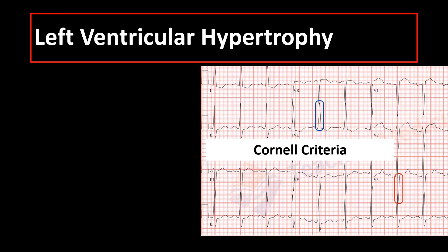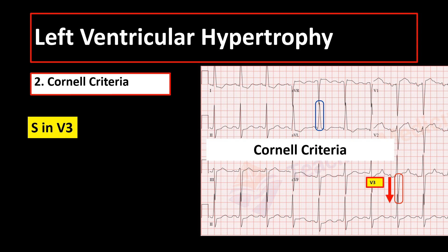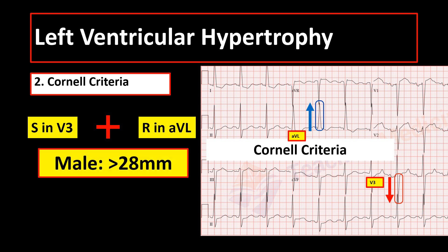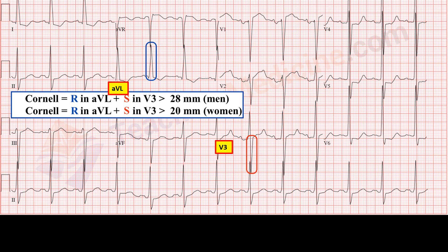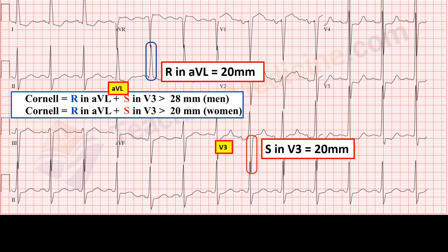The next criteria is the Cornell criteria, which is the sum of the amplitude of the S wave — the negative deflection in V3 in millimeters — plus the amplitude of the R wave — the positive deflection in AVL in millimeters — is more than 28 millimeters in male or more than 20 millimeters in female. For example, in this case, the patient is a male. The S in V3 is 20 millimeters and the R in AVL is 20 millimeters, with a total of 40 millimeters. So this is left ventricular hypertrophy by Cornell criteria.